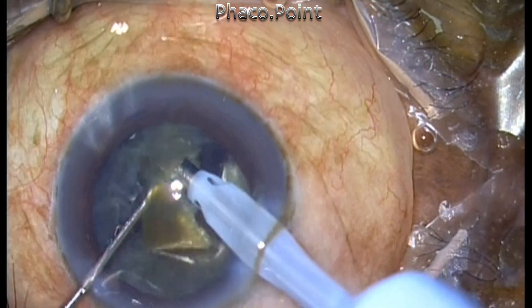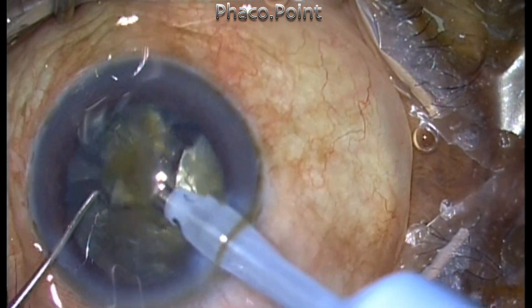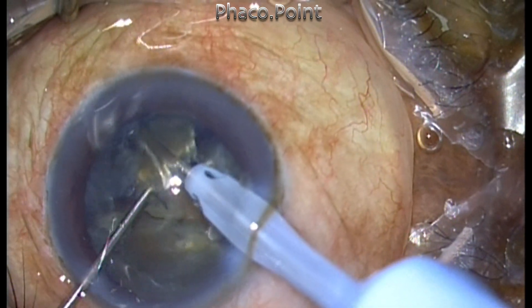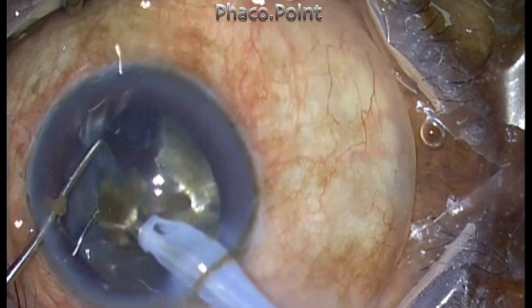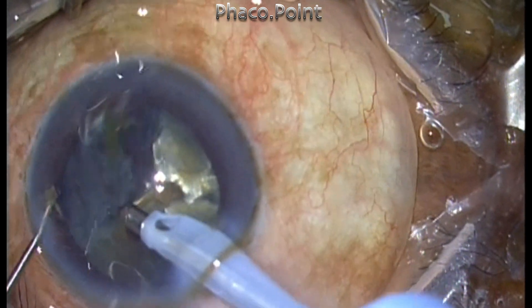Use mechanical forces to create the fragments, so you will not be using ultrasonic power while creating them. Power is consumed only while removing the fragments. A smaller fragment will enable you to use more vacuum and lesser phaco energy in order to evacuate it.